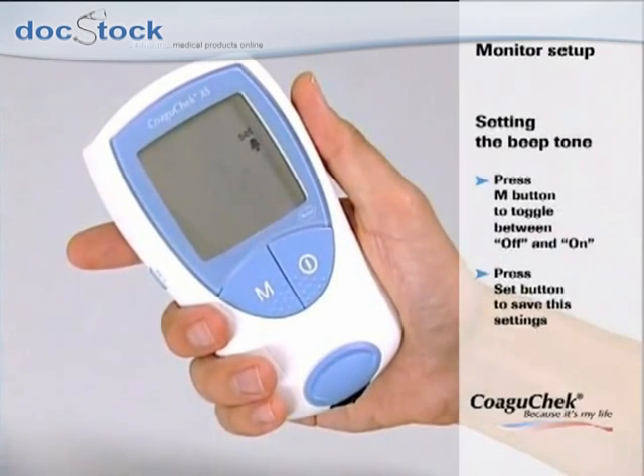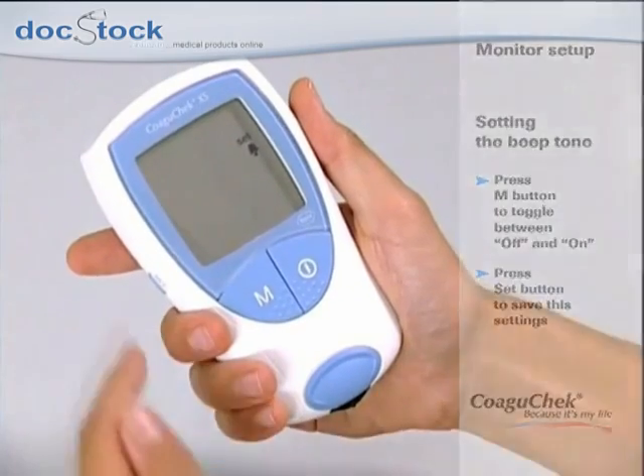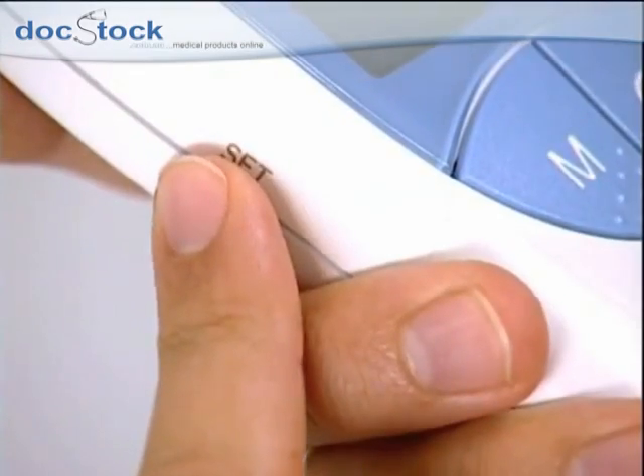Now you can choose whether you want the beep tone off or on. It is recommended to leave the beep tone turned on. Please press the set button to save your setting.